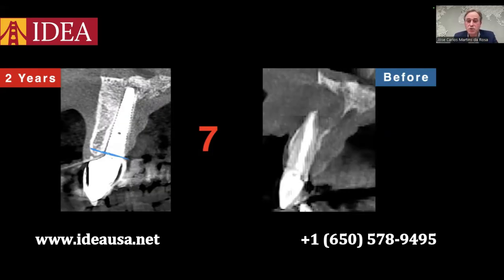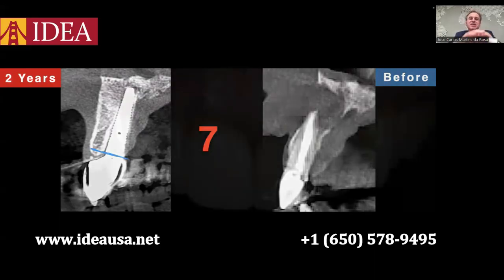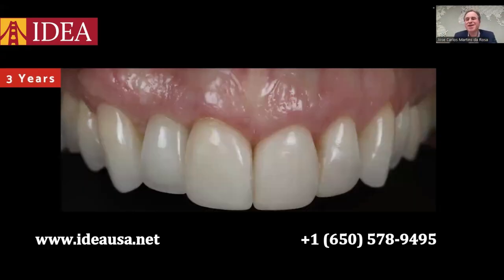It's predictable, it's minimally invasive, we can deliver the provisional restoration immediately, and the patient is very happy because only one surgery is enough to manage, regardless of the extension of the bone defect, regardless of the severity of the bone loss. So this is the post-op after 3 years.